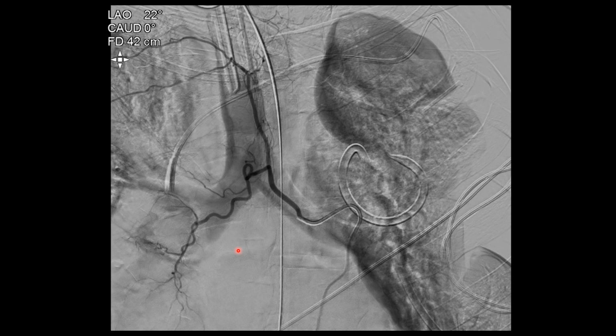In this case, this is one of the areas where we do not want to use coils. So people who have hemoptysis will often recur hemoptysis, and if we put a big coil here and the patient recurs, gets new blood vessels, and they're symptomatic again, we're not going to be able to get to them and treat them. So in this case, we like to use particles to go in here and stop the blood flow.